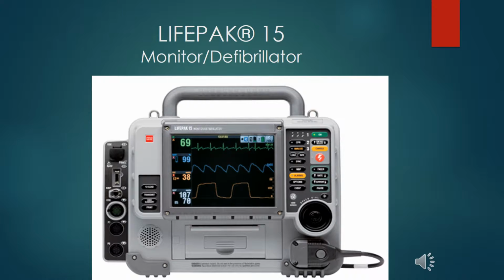I wanted to show you an example of a high-tech EMS, paramedic, firefighter monitor and defibrillator called the LifePak 15. This does everything. You can defibrillate, you can monitor the cardiac rhythm. In the upper left-hand corner is where you would plug in a microstream line or an inline CO2 detection device, which would siphon back.